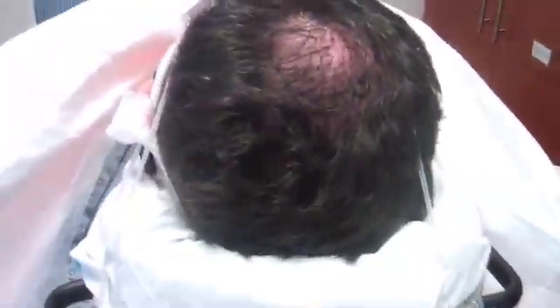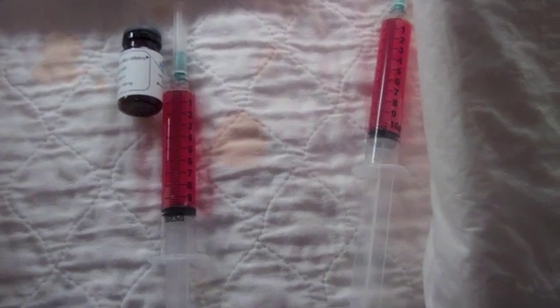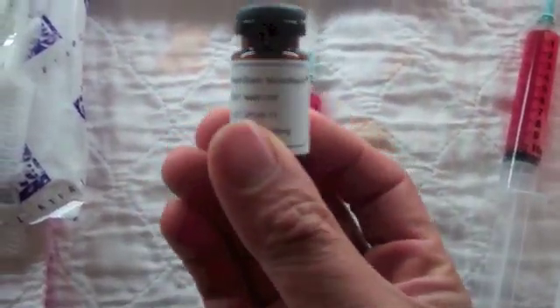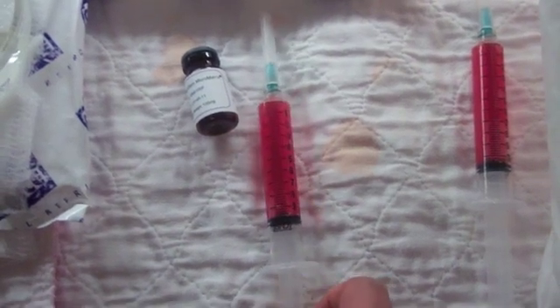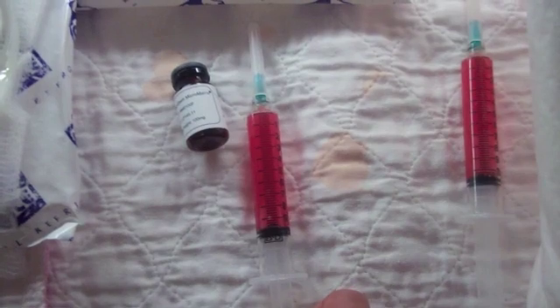Things are going really well — can't wait to correct these things back here, this is going to look awesome. What you heard earlier is we harvested the blood and centrifuged it out, so we have platelet-rich plasma. This is also A-cell, which is porcine bladder matrix, and the two together are really revolutionary in terms of graft growth. We've been using it for about the last two years, and I've been super impressed by the consistency, the hair caliber, and the growth.